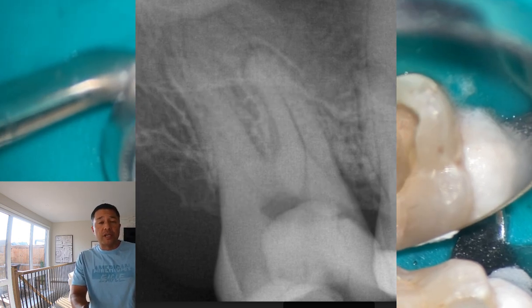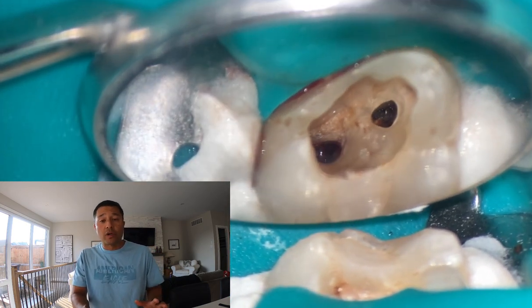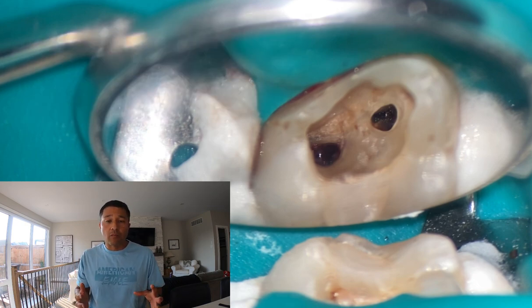Then what happens is they get in and they can't find distal buccal. So that was really the question: can you help me find distal buccal? So what happened was I sat down, put on my camera, and let's take a look at what I was seeing.